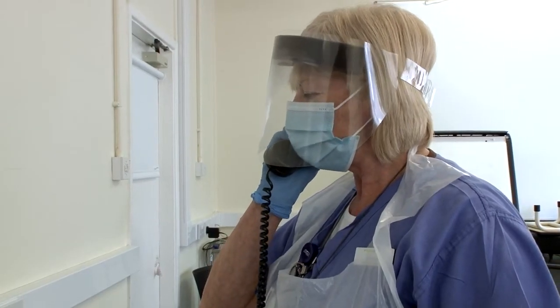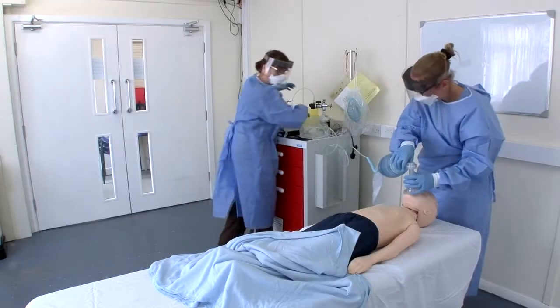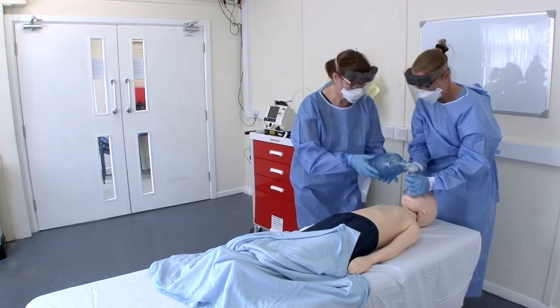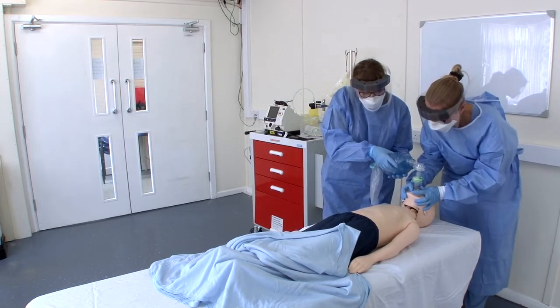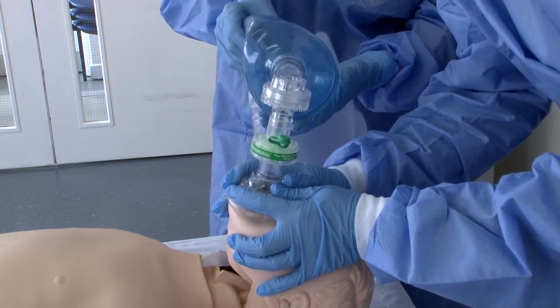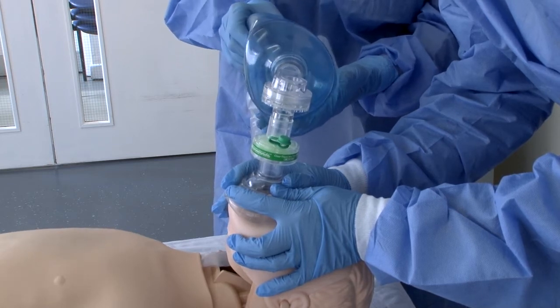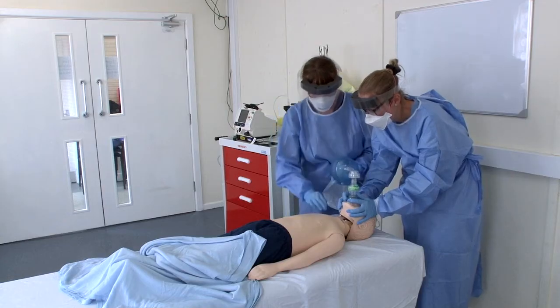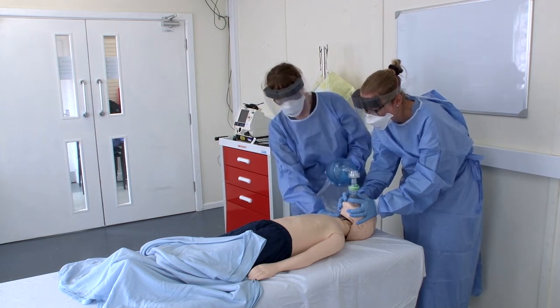Paediatrics resuscitation team, Ward 16, ground floor. If the child is not breathing normally, give 5 rescue breaths using the bag valve mask device with 15 litres of high flow oxygen attached, with an inspiration time of about 1 second. Ensure good chest movement. Check for signs of circulation or signs of life, taking no longer than 10 seconds.